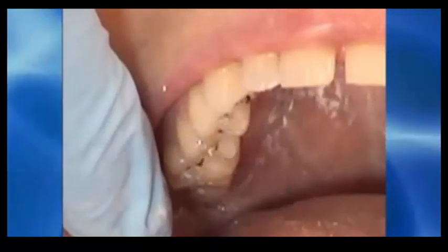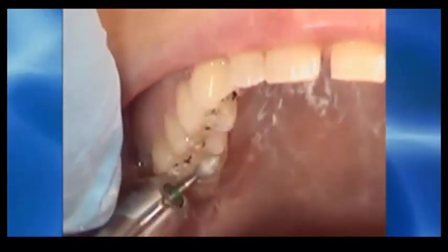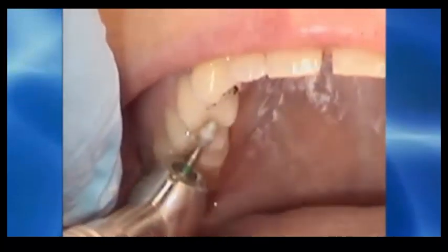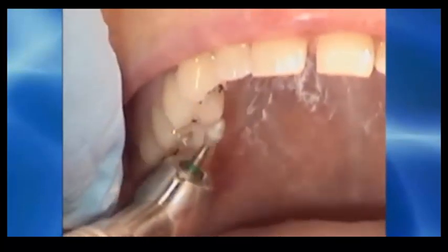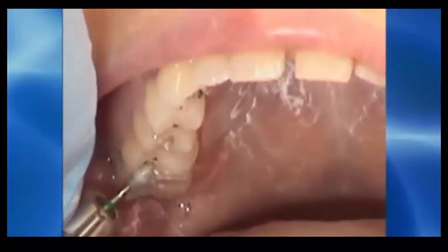On the opposing upper right side, here you see contact in the central fossa on most of the teeth, and slight contact, scratchy little lines and inconsistent contacts all around the contacts that are desirable in the central fossa on the marginal ridge. A good example is here on the buccal aspect of the first molar.